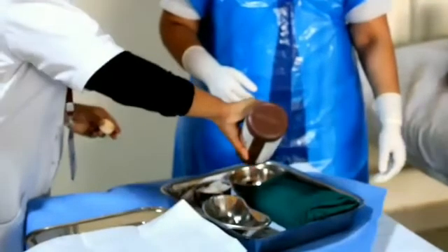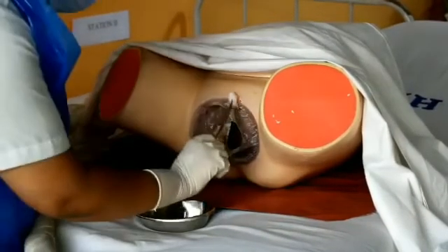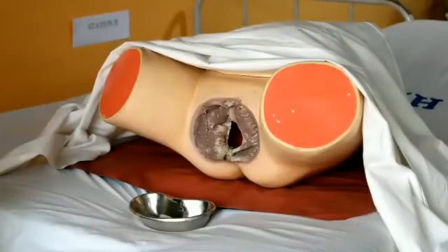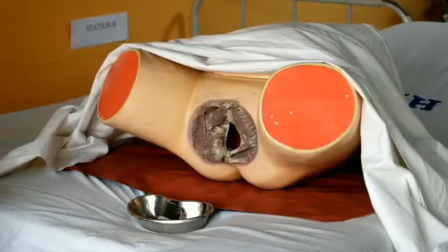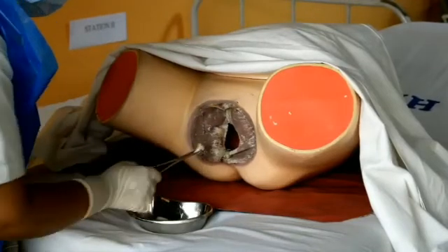Cleaning of perineum. First, pour the betadine solution in the sterile bowl. Soak the cotton in betadine solution and start wiping the labia majora in one stroke. Discard the cotton. Again, soak another cotton in betadine solution. Then we have to wipe the other side of the labia majora in one stroke.